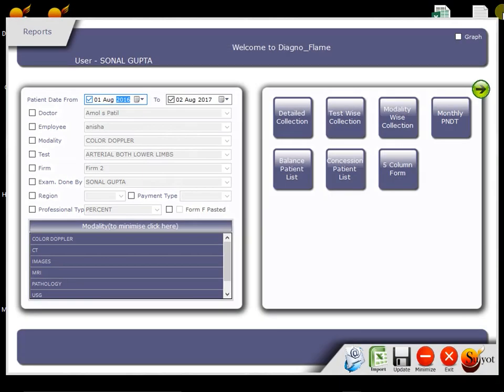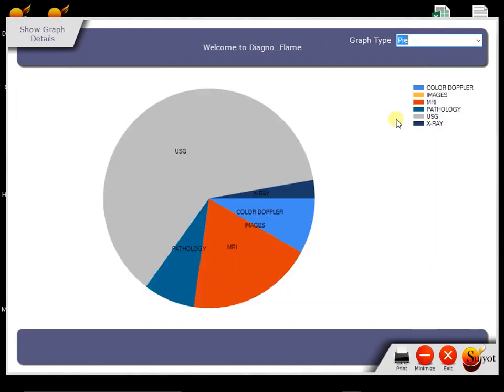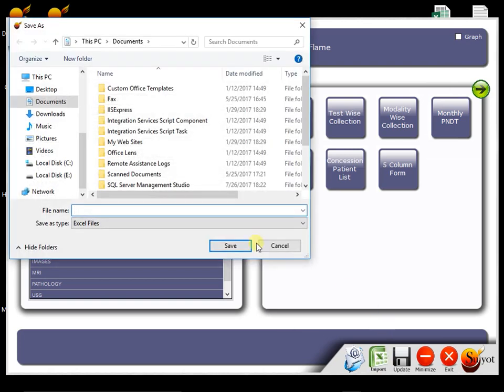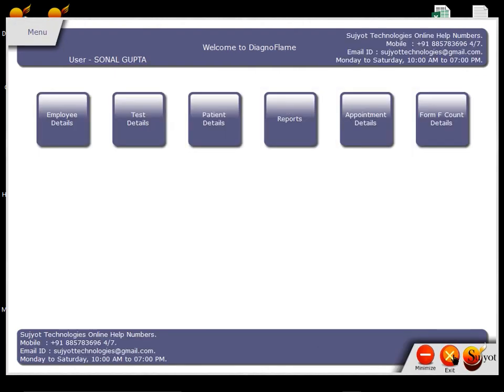We can also view each summary graphically by clicking this graphical tick. We can export any summary report to Excel too by clicking this Excel button. Software takes automatic database backup when we close software. So there is no chance of data loss.